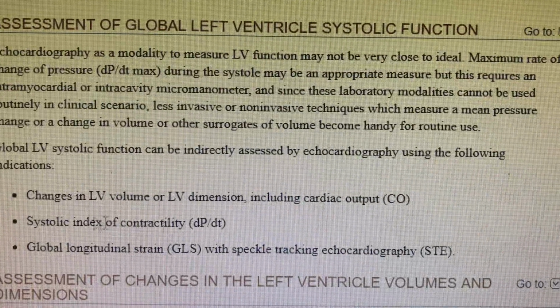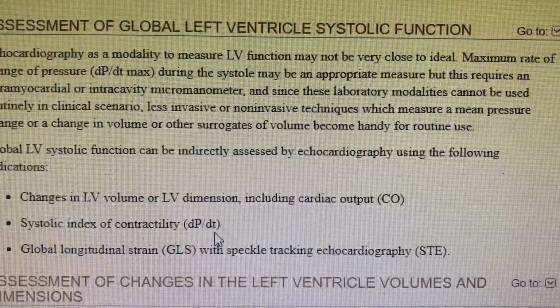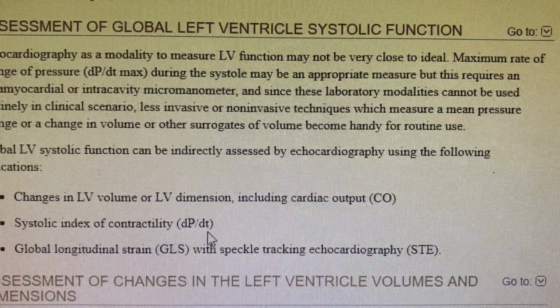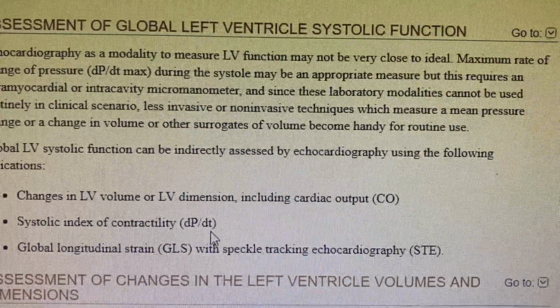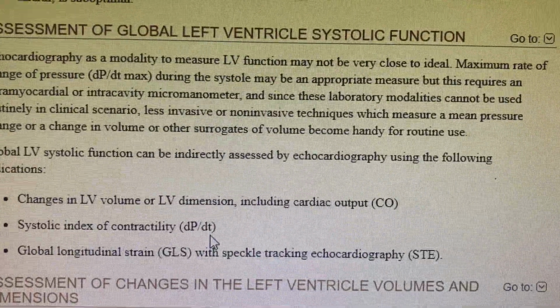The next is the systolic index of contractility, that is dP/dt. This is one of the best markers, dP/dt, when we do cath procedures in the cath lab. When coming to echo, it is still considered one of the best markers, but it still has some limitations.